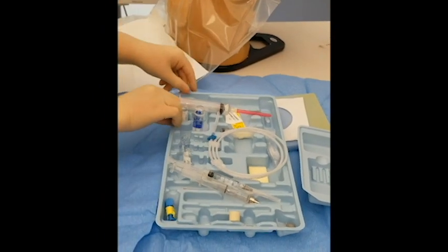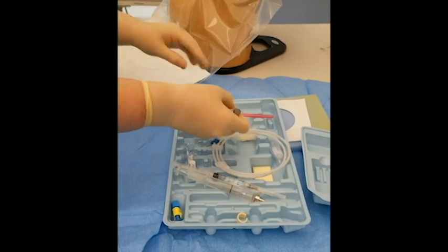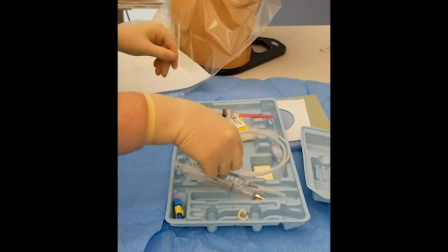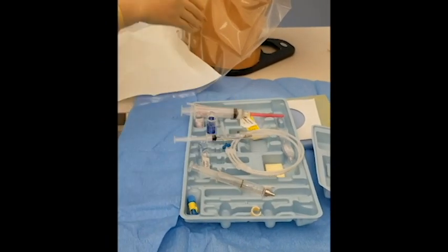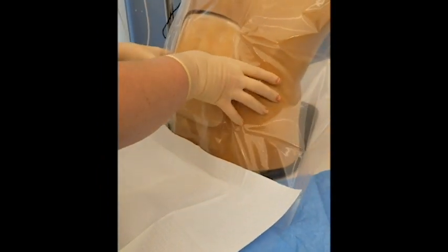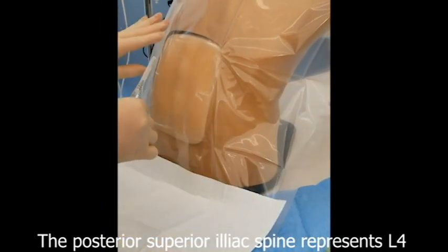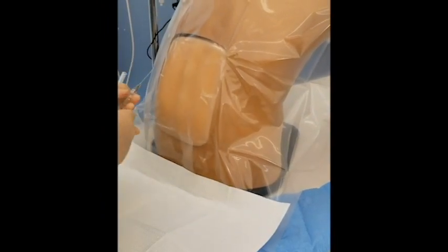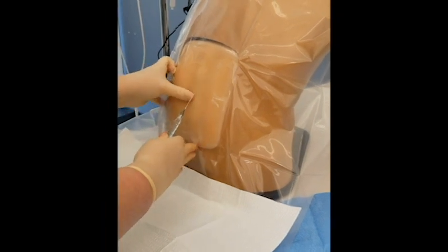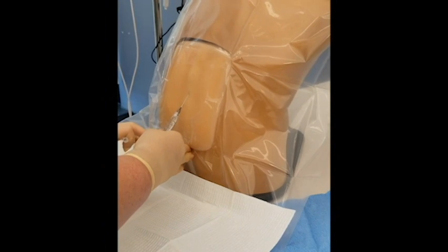Place a 25 gauge needle onto your lidocaine 1% syringe. Again, feel your landmarks on the patient, and start to make a small skin wheel.